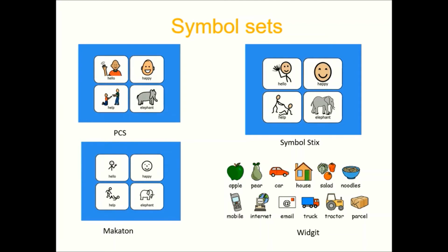So there might be a particular symbol set that the day centre or the college or the respite centre uses already, and then it's a good idea to try and match that if you've got access to that same symbol set. Otherwise, your clients are having to learn a new symbol set, which can be a bit tricky.